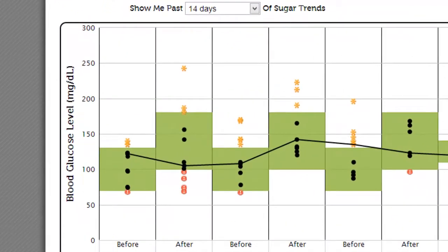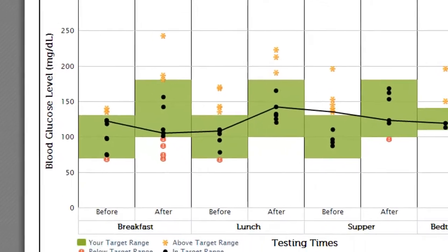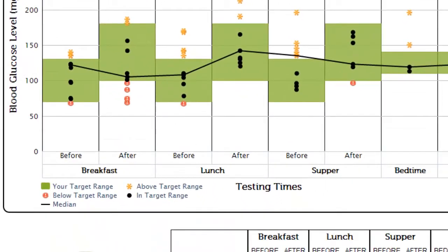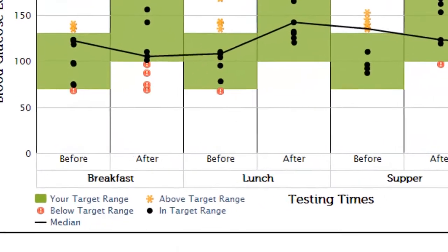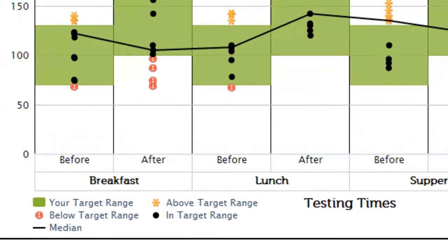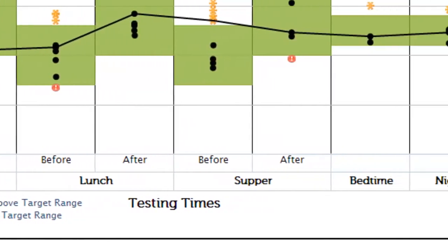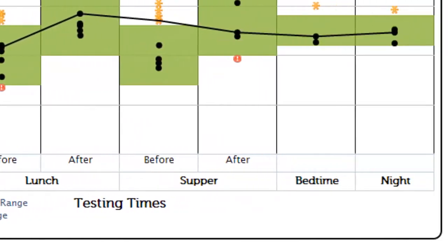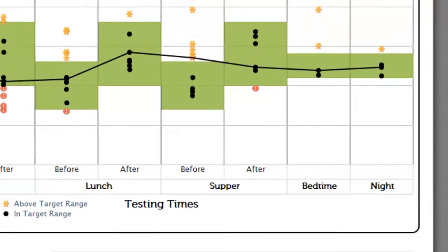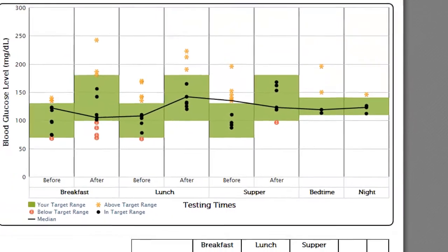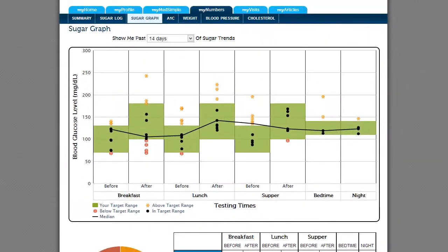On the left-hand side of the graph are potential blood sugar numbers. Along the bottom, you'll find the day parts you may regularly test: before and after breakfast, before and after lunch, before and after dinner, bedtime and at night.